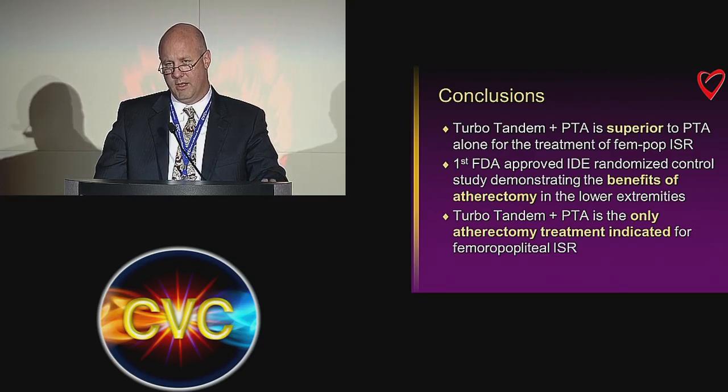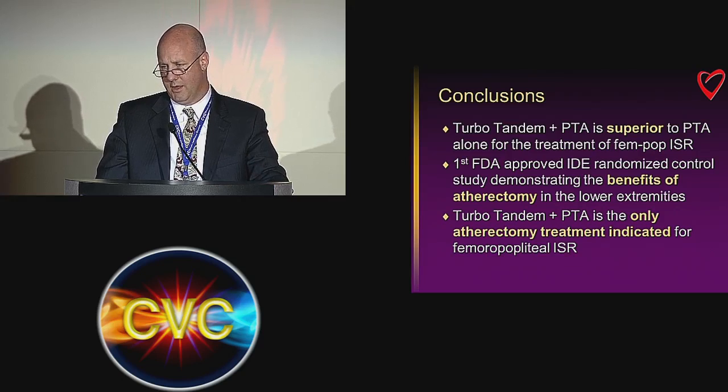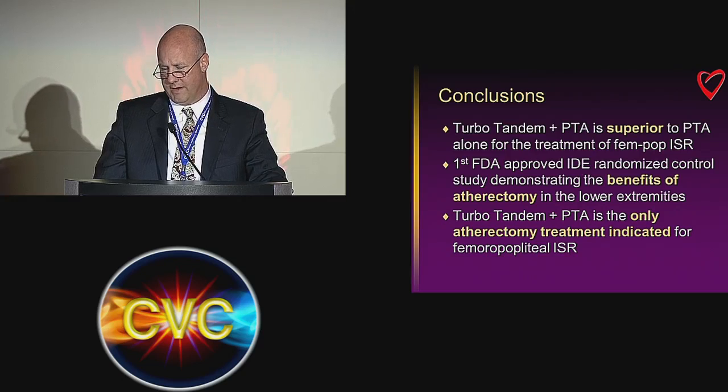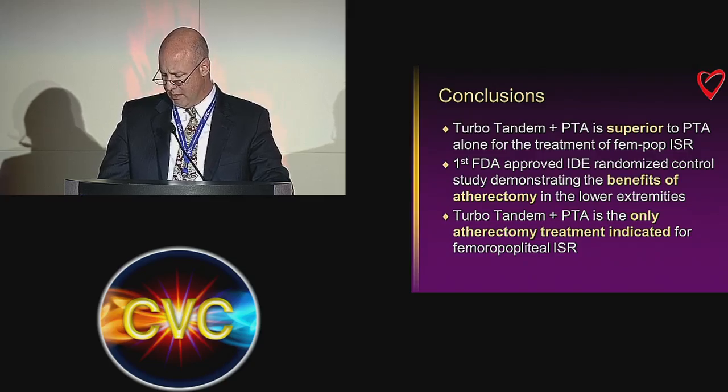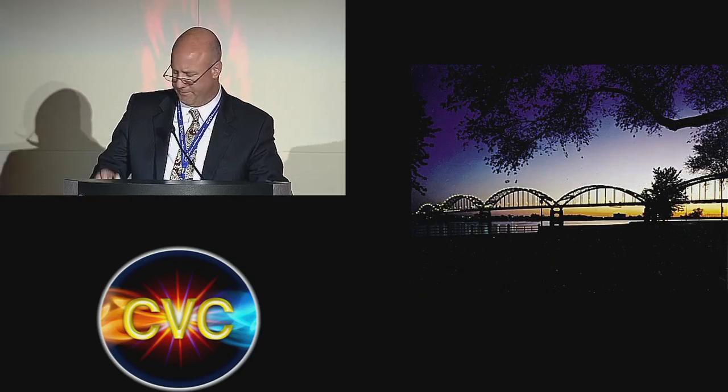I think the data is very encouraging. It's promising. And it may be that a combination of therapy, possibly debulking with the laser, a drug-coated balloon, and then a Viabahn, may be the ultimate solution. Because even with the data that I've shown you today, the TLR rates are not 0 at 6, 12, and 24 months. So I do think that we have not solved this problem yet, and hopefully we're working towards that. Thank you for your attention.